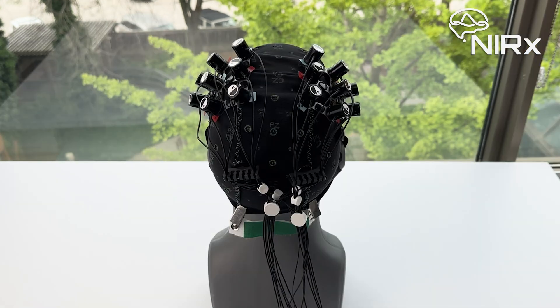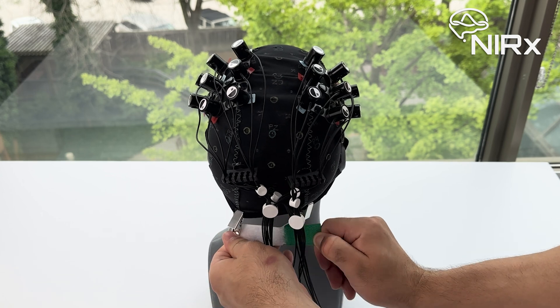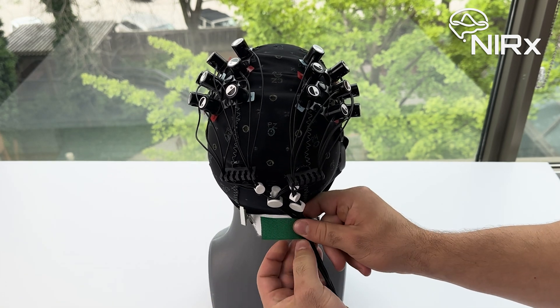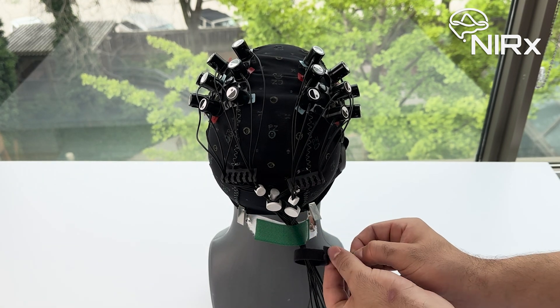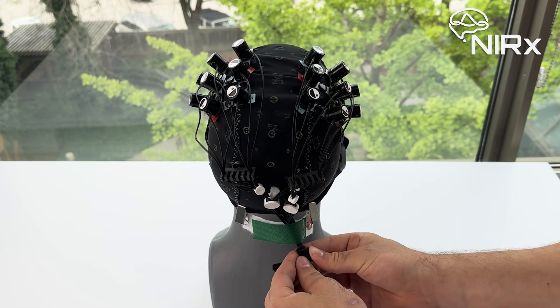Once finished populating, to distribute the weight of the descending wires and preserve signal quality throughout your experiment, clip the green velcro strap to the back of the cap. Bundle and attach the wires to the back of the cap using the velcro strap. You can also use the provided black cable tie organizers to tie the cables together. This is particularly handy in setups with higher optode counts to keep things organized.